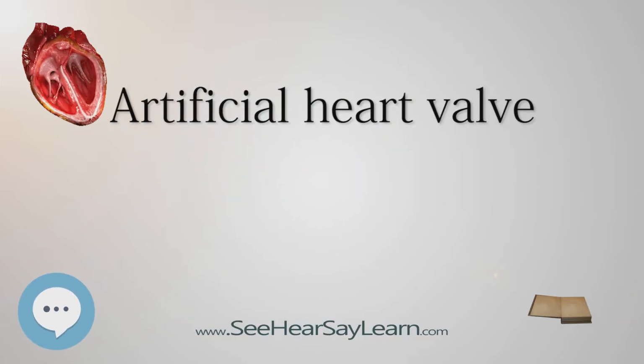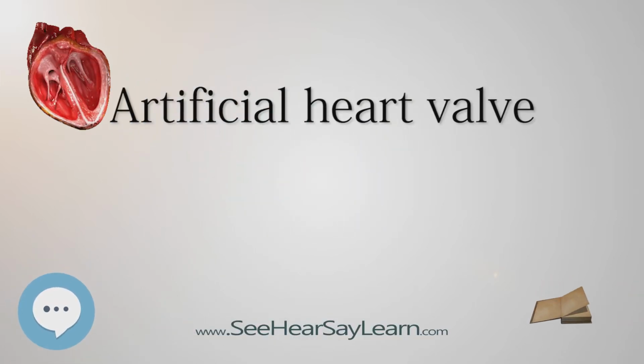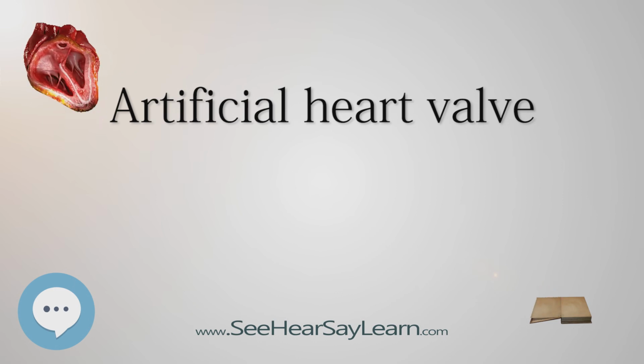An artificial heart valve is a device implanted in the heart of a patient with valvular heart disease. When one of the 4 heart valves malfunctions, the medical choice may be to replace the natural valve with an artificial valve. This requires open heart surgery.